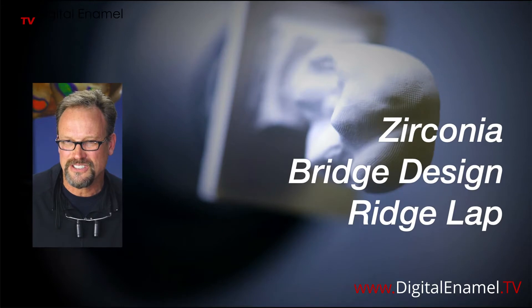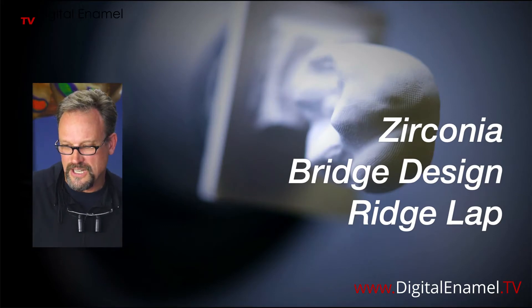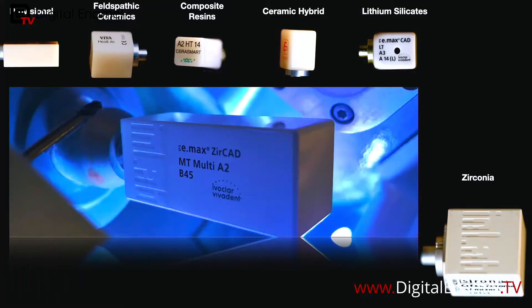Let me get my window up — there we go. First thing I'm going to do is show a quick case of what I mean by this, and then go into the CEREC software to describe how to get a better ridge lap. Let me switch over to my software.